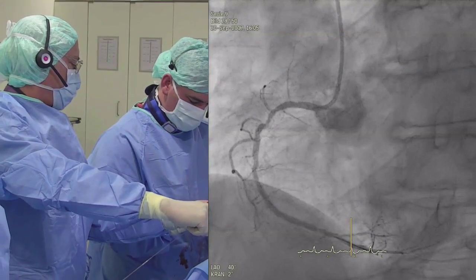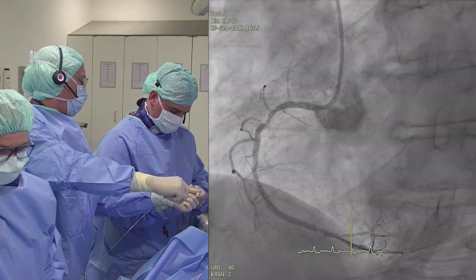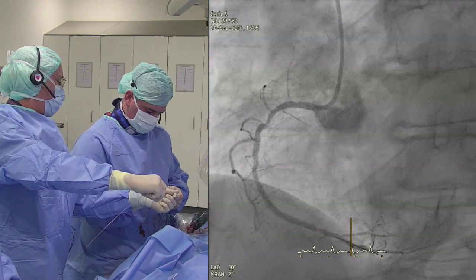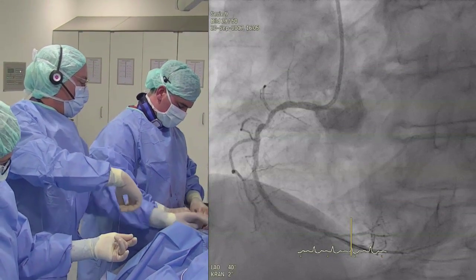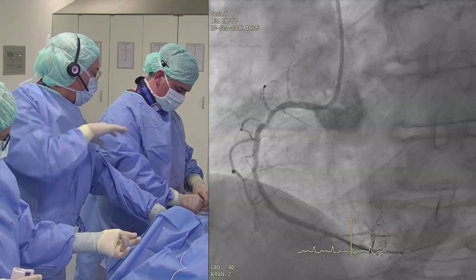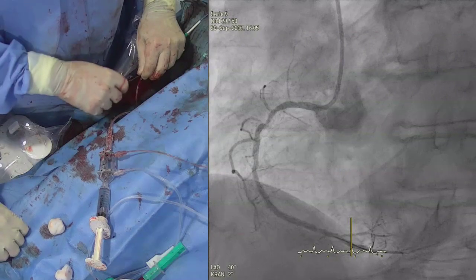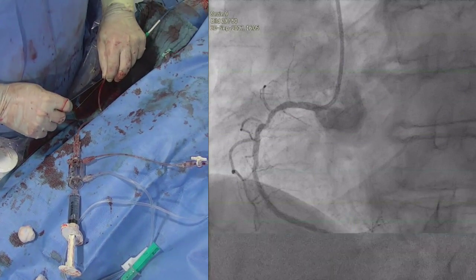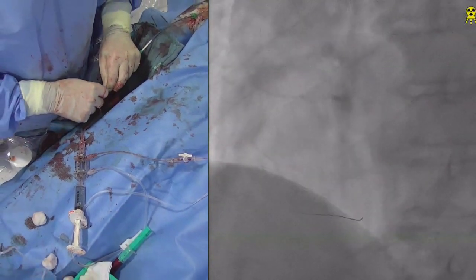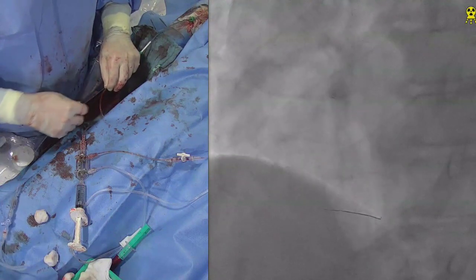And what if it's infused in the arm? Well, that's why ACT is a safety measure. You just check that the ACT went up. We had a couple of cases in which the patient had massive intracoronary thrombosis during the case. With long procedures, definitely that's good, but routinely for simple PCI procedures, we do not. So Bernadette was asking what happens when there's extravasation of the heparin into the arm outside of the vein, and that's why the ACT is always a safety reminder in the cath lab.